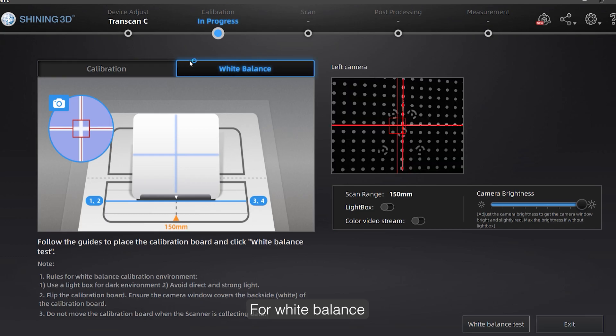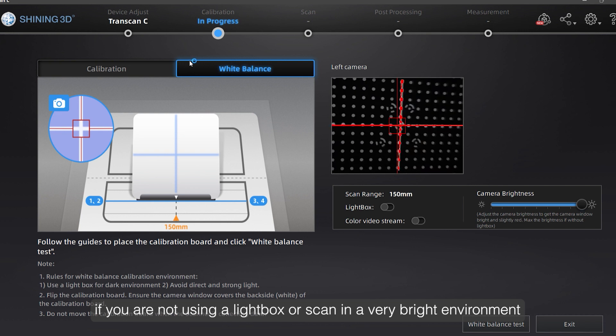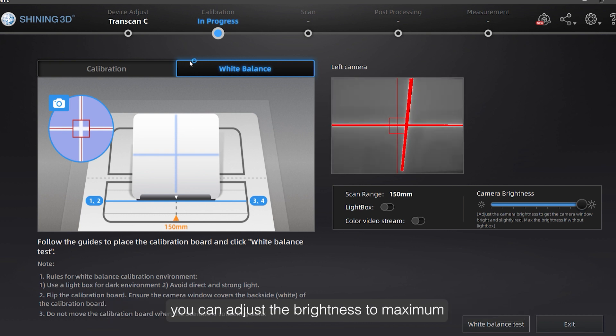For white balance, if you are not using a light box or scanning in a very bright environment, you can adjust the brightness to maximum.